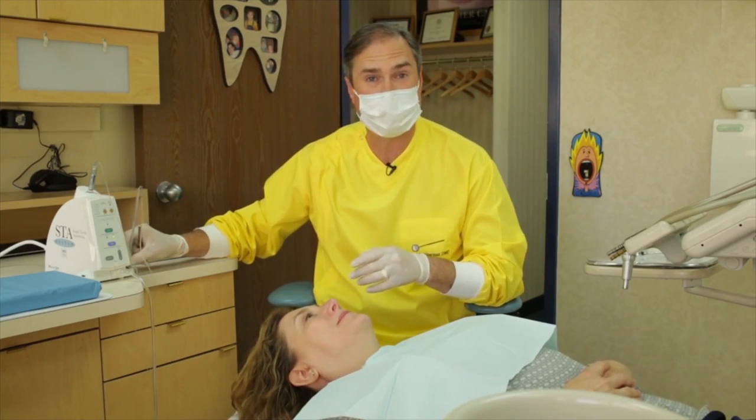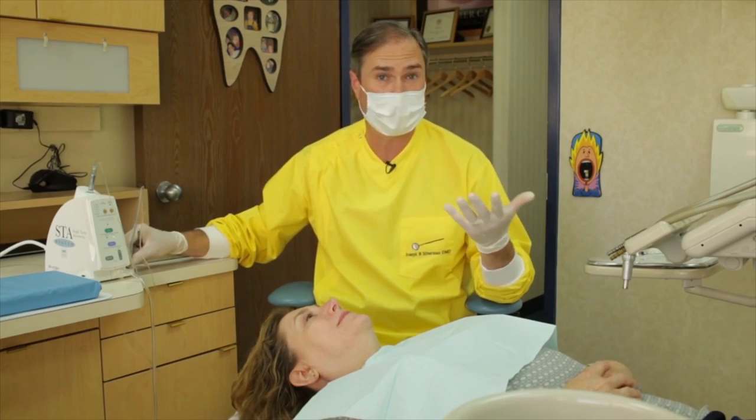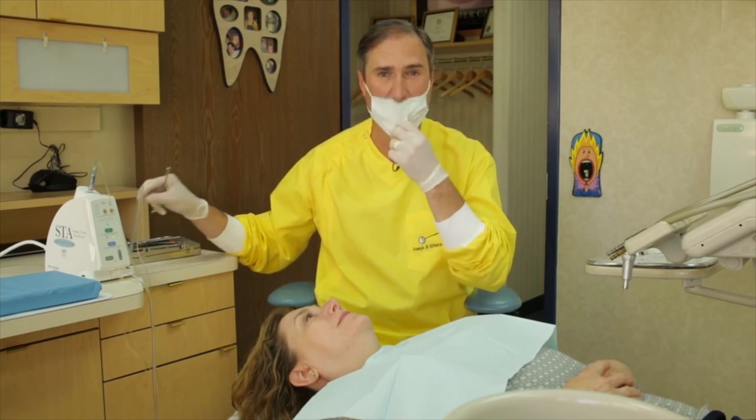Lots of times patients will say to me, 'Dr. Joe, you didn't just make me numb, right? You didn't just give me a needle.' They have no idea that, in fact, I did give them a needle. That's why the wand is a great device. This is Dr. Joe, keeping it clean.